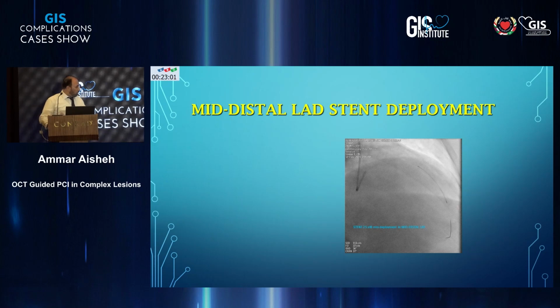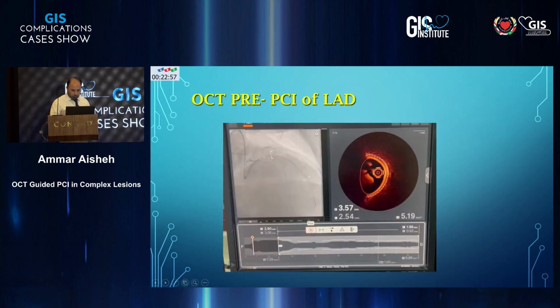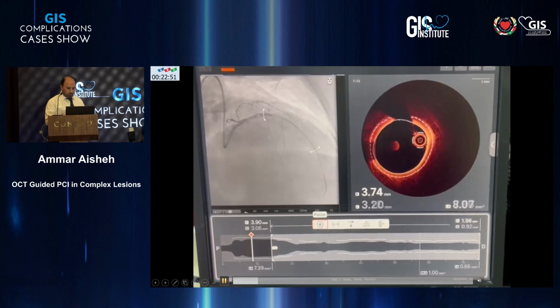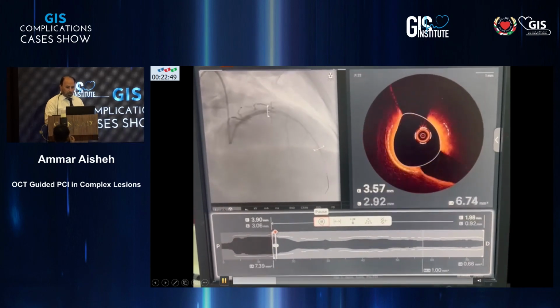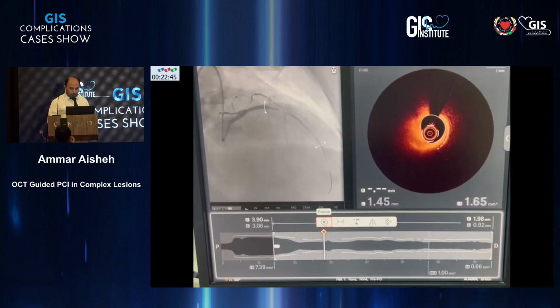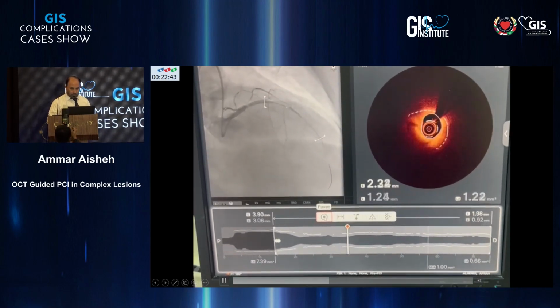Let's just pause here and go to the OCT again, because we would like to make it more educational and interactive. Sure. What is the finding that we're given out of the OCT? Maybe Wael will. This is OCT Ultreon 2.0.